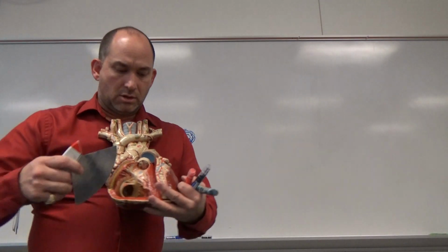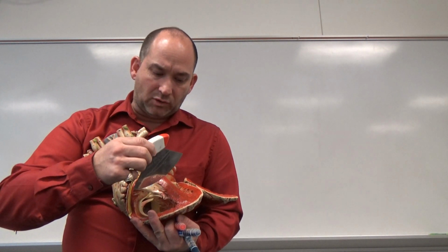Okay, so we're 90 degrees to this. So my indicator side here is going to be, we're starting at the valves at that base level. Then we sweep down slightly to the mitral valve level. Open this up. And then I'm sliding my transducer down so that I'm perpendicular to it here, looking at the papillary muscle level, mid-LV.